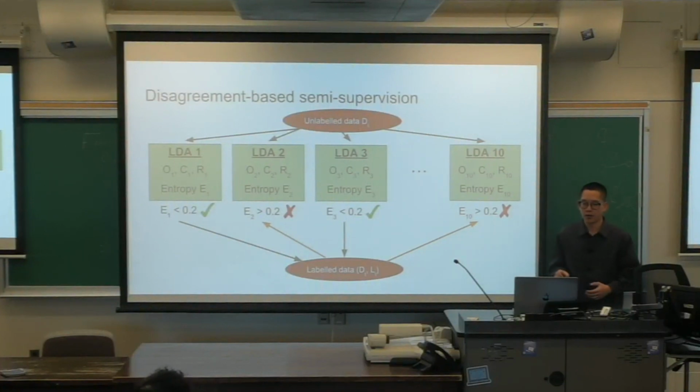And we add this newly labeled data into the data buffer of the unconfident classifiers. We have a data buffer for each classifier. When enough data has accumulated in the buffer, we run an update, using the newly labeled data to update the classifiers that are not confident. That's how we achieve information transfer between confident classifiers and unconfident classifiers.